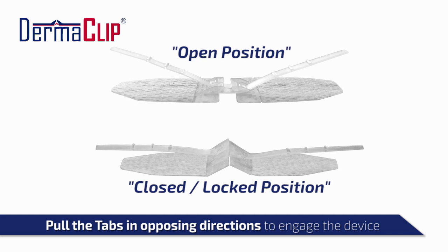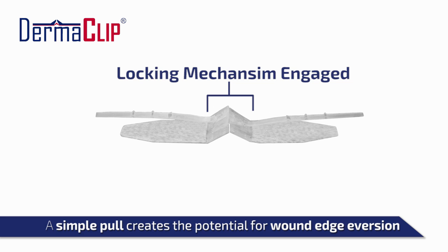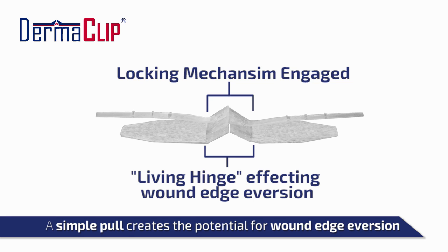To engage the lock, the tabs are pulled smoothly in opposing directions until a solid click is heard and felt. When locked properly, the angled faces will be pressing firmly against each other in a near-vertical position, as shown in the picture.